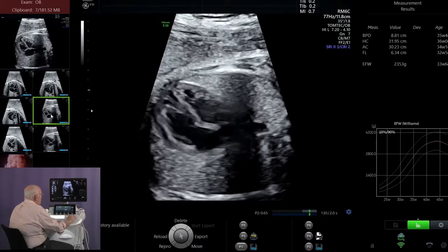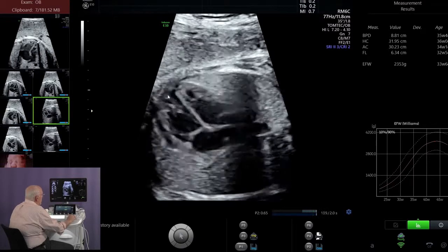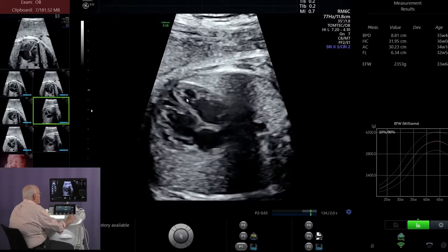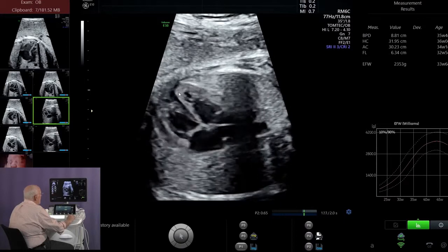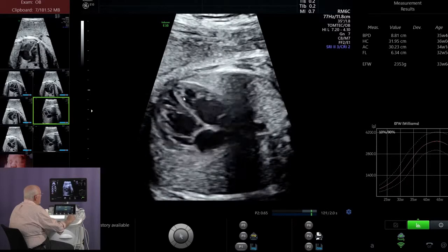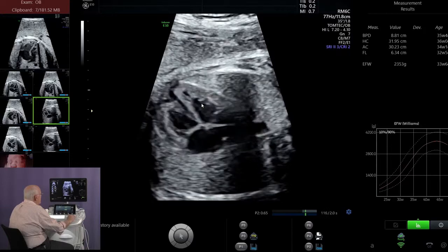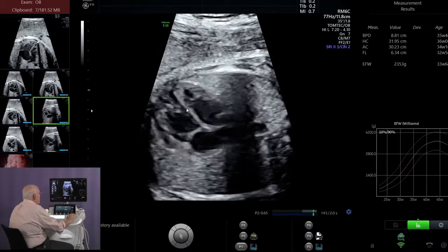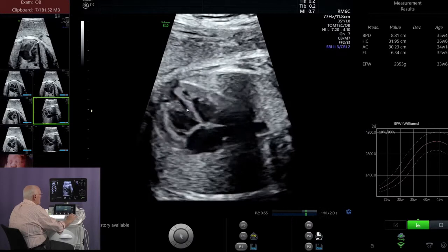This is another example of reorienting the four-chamber view, and this is probably ideal because you're at about a 45-degree angle to the ultrasound beam. You're actually combining lateral and axial resolution. You see very nicely the interventricular septal wall. Here's that bright echo that I mentioned earlier, and here is the septal wall of the left ventricle. So we have nice valve movement and a nice delineation of the walls of the heart. And this is probably the very best orientation for acquiring an image for fetal HQ analysis.